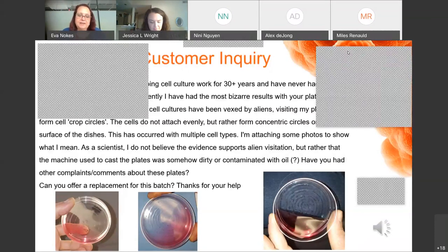These are cystic fibrosis cells, so they grew on a monolayer on a Corning Snapwell plate so that the air can be on the top, and they actually get all kinds of mucus buildup. So you have to go in and suck off the mucus and clean them and feed them. But if you treat them right, they can go for a long time, totally dependent on the cell type.